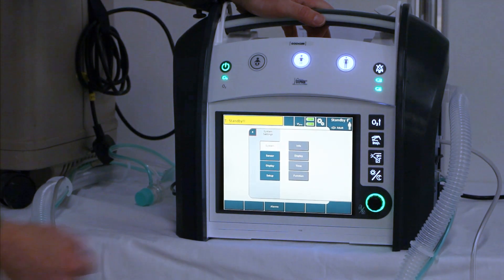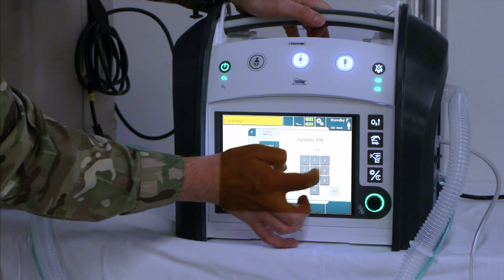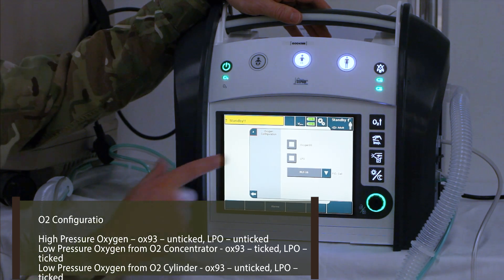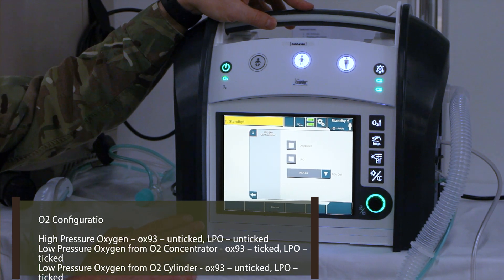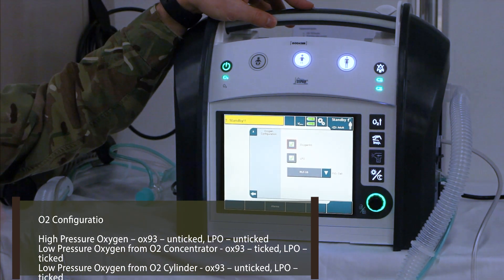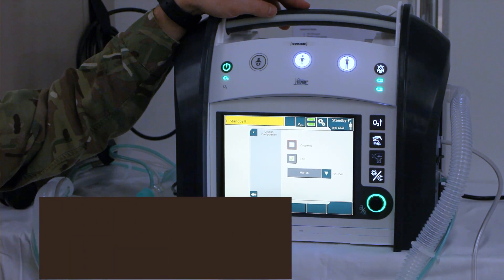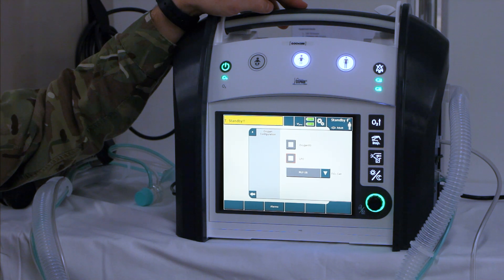We'll click on the settings button, which is the cogs, then click set up and put in the code, which is 1968. Click next. We'll then go to the top left where it says oxygen configuration. If both of these are deselected, we will use high pressure oxygen. If you want to use the oxygen concentrator, you'll use low pressure oxygen — tick LPO and tick oxygen 93 when using the concentrator. If you're using low pressure oxygen via a cylinder on just some bubble tubing, oxygen 93 should be off. In a standard setting, both of these will be deselected because in routine practice we use high pressure oxygen.